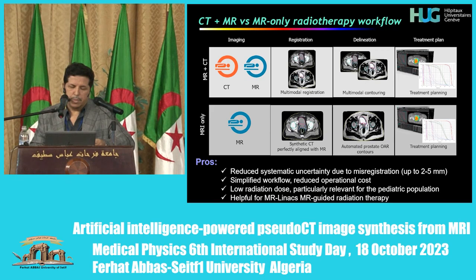And obviously, the major problem that I'm going to address today very quickly is how to synthesize a pseudo-CT image from the acquired MRI scan. The pros of moving from CT plus MR to MR-only radiotherapy are summarized here. As I mentioned in the beginning, you reduce the uncertainty due to misregistration.